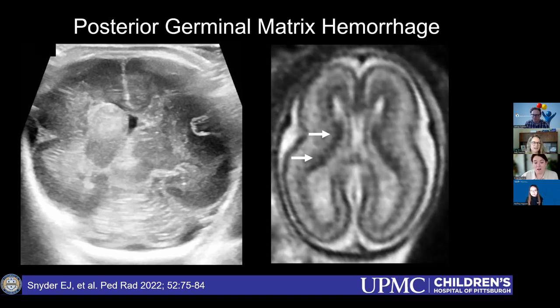I was always taught that germinal matrix hemorrhage is like hips. You grade it on the first one and then you describe what happens on follow-up. So I would actually love the ability to say, oh, just kidding, now it's a grade, whatever, however it's changed. One of the things I always say is be descriptive. So I just describe what I see as best I can and how it's changed. I don't have a good answer though.